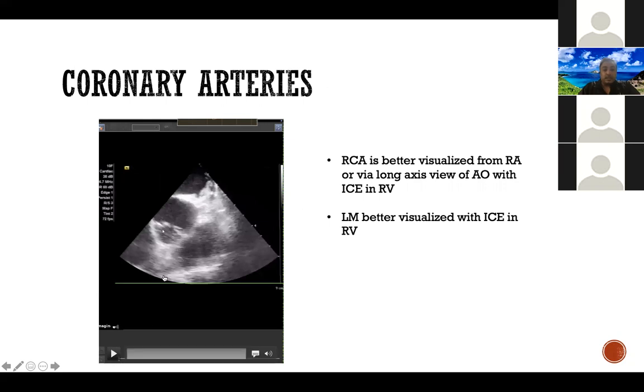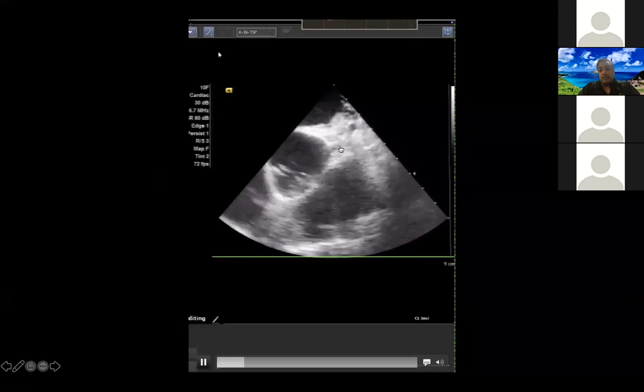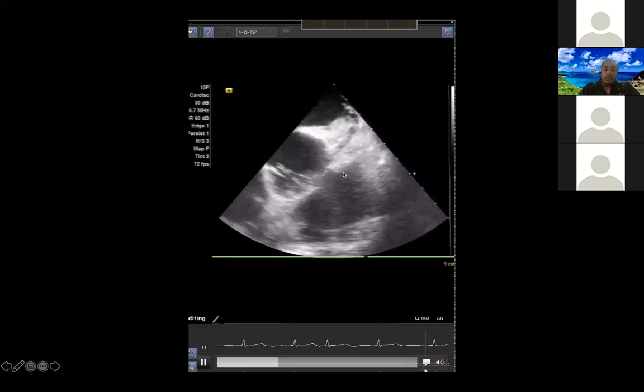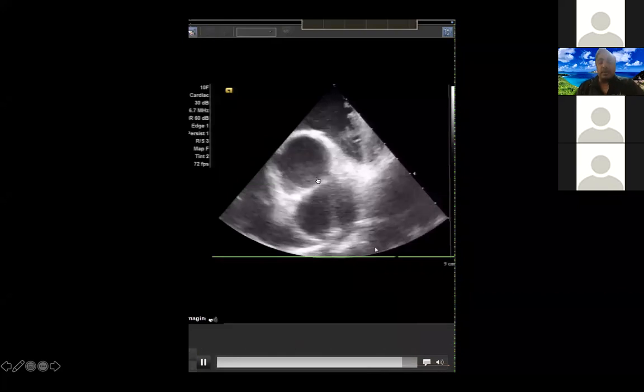So this is what I wanted to show you here. Here you see I'm in the right atrium, and you have a beautiful view of the right coronary artery. And then oftentimes, if you're using CartoSound, you can have someone take a contour of the right coronary artery, so you have a good idea of where the takeoff is, and that will make your ablation safer if you decide to burn in the cusps.